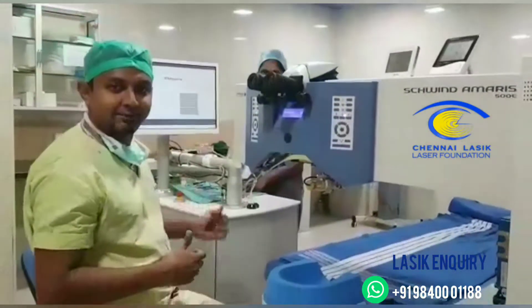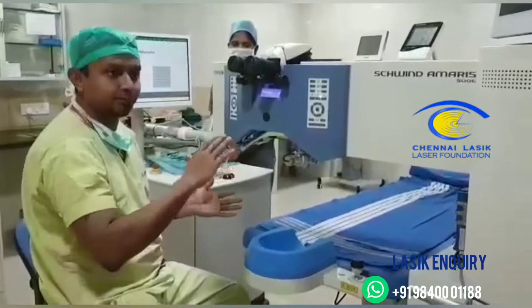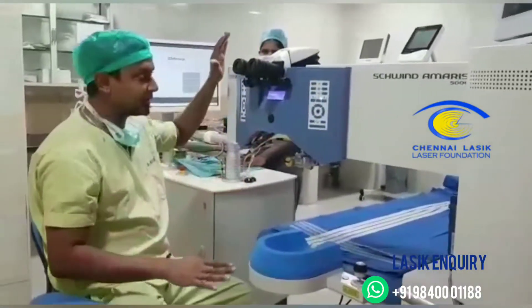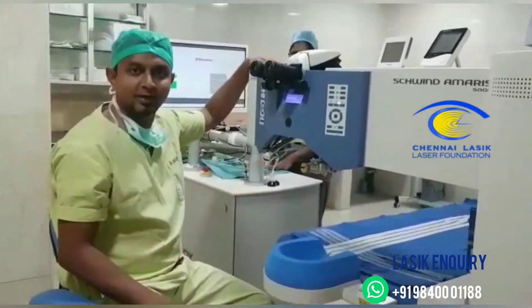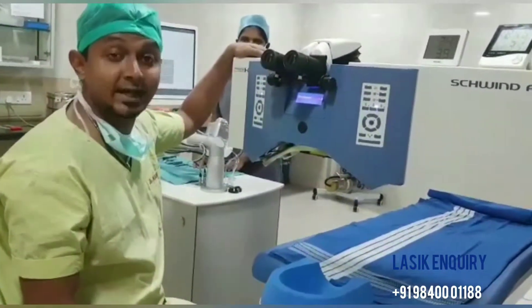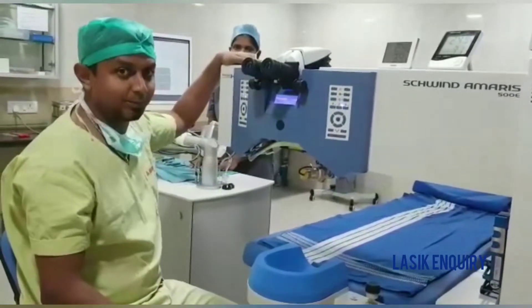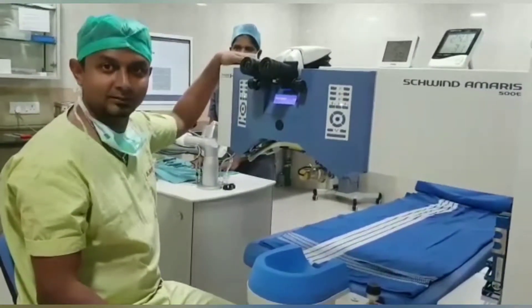That is it — the Femto Z4 LDV from Zymer, combined with the Schwind Amaris 500 with the best eye tracking system and static cyclotorsion correction for astigmatic patients. Patients are really happy in the end. Thank you.